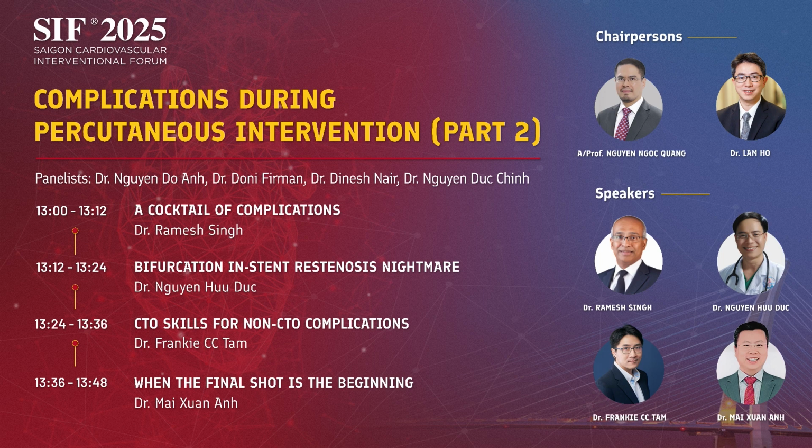Yeah, we decided PCI for the diagonal because the FFR was positive after we did the cutting balloon, and on IVUS I could decide to use a 2.75 stent. But after the stent inflation, we did the POT with 2.75, and after that we did the POT dilation for the diagonal. I wanted to use 2.75, but my colleague gave me 3.75, and rupture happened.